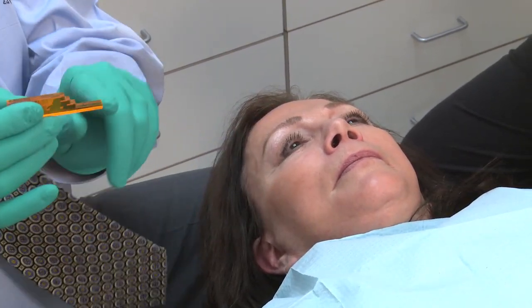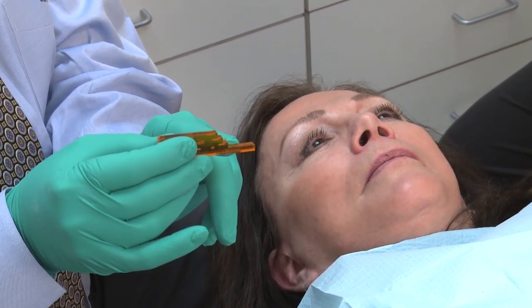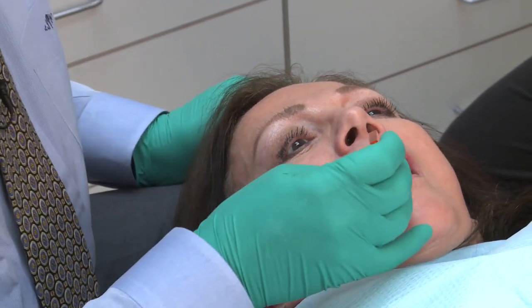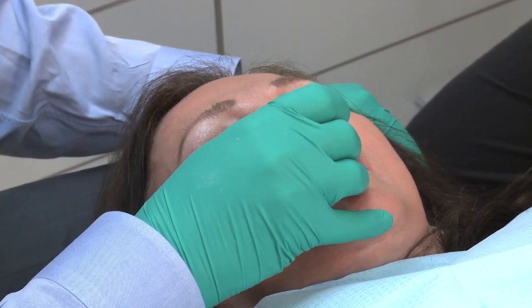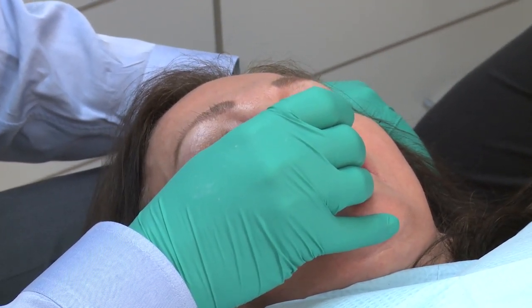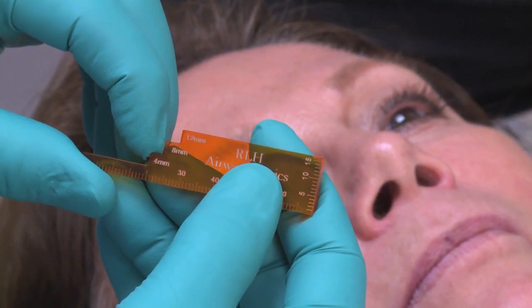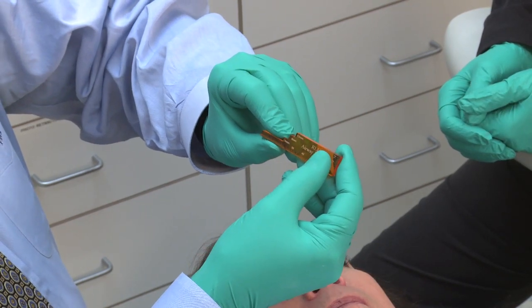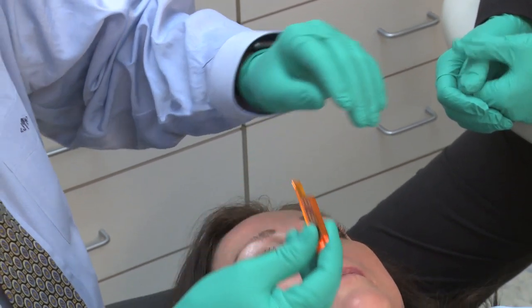So you're going to place the first step in between her maxillary and mandibular anterior teeth, and we'll have her snore. Let's give it a try, Kim. Go ahead and close. Give us your best snore. What do you think, Tammy? I still hear a little bit. Yeah, me too. So let's go to the next level, which would be 8 millimeters of vertical, and see what effect that has on Kim's snoring.